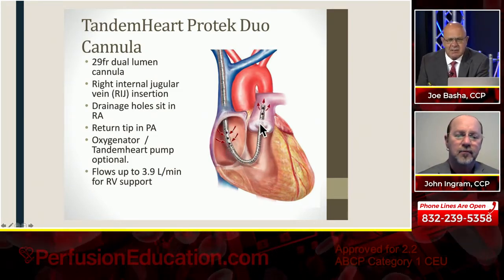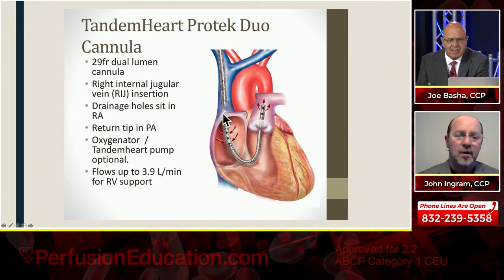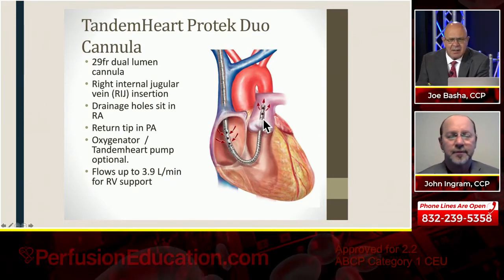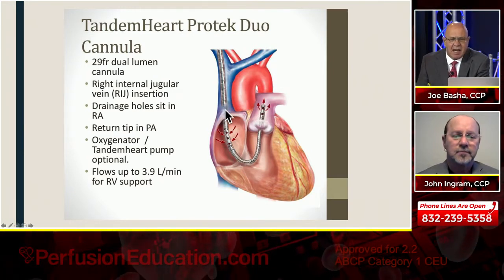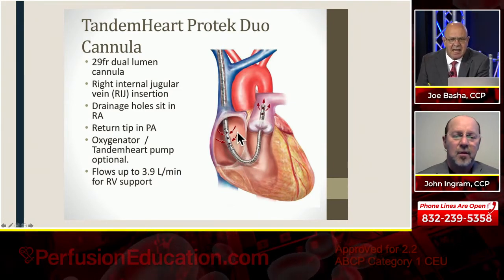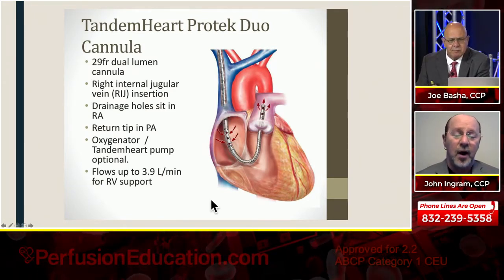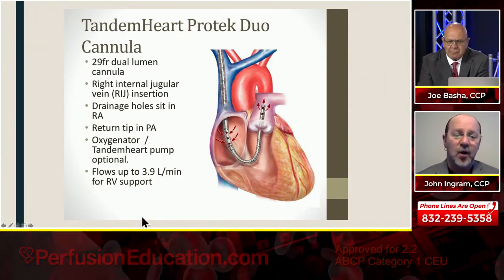And besides that, it's like the Tesla ludicrous speed. Its price tag is ludicrous as well, and I think that's something that just needs to change. They charge about $18,000 per kit, and just the cannula, which you cannot buy here in the United States, you can in Canada, is $11,000, whereas an Avalon catheter is somewhere in the neighborhood of $2,500. For a while we were opening the box just for the cannula. We've since stopped doing that.